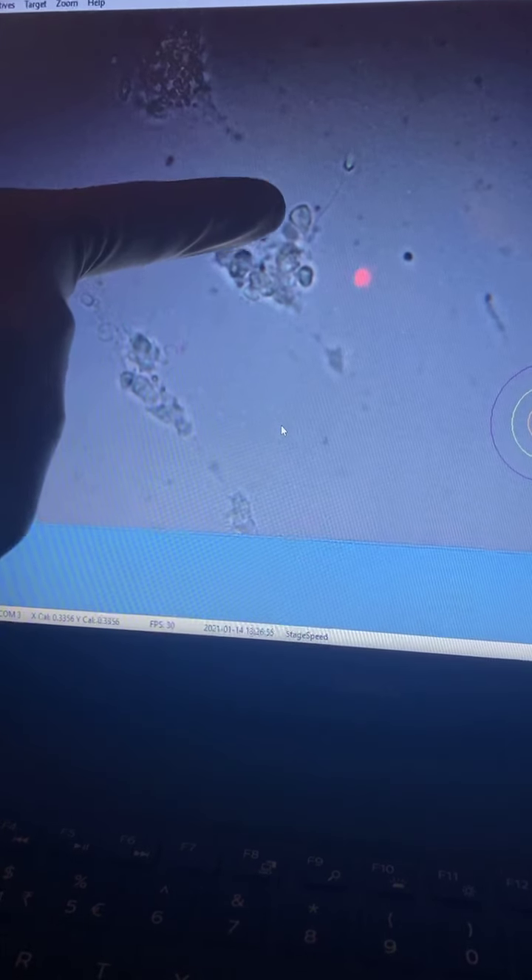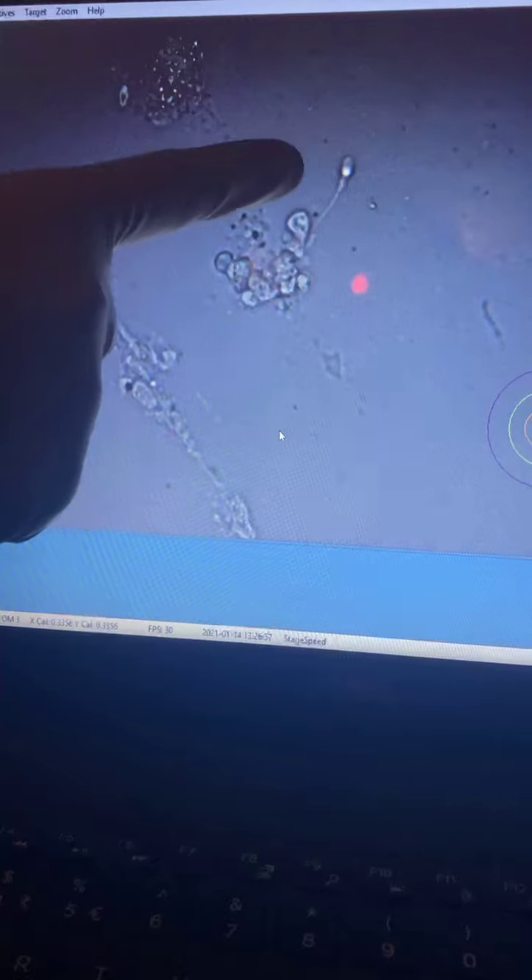The importance of this technique is to find sperms in azoospermia — it is very important to do this technique in the right manner. See — one more sperm. This is a beautiful sperm which I am going to be using. So I've got good four to five sperms now.